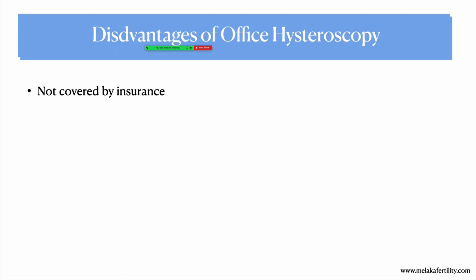One famous Belgian hysteroscopist says that he will do an office hysteroscopy, and if he sees a polyp, he will stop, and then he will take the patient to general anesthesia to do the polyp, because the insurance doesn't cover removal of polyp in the clinic setup. We are not the same, so we just do what we can in the clinic. So it's all boiled down to how the insurance companies are paying for what you can do in this setup.